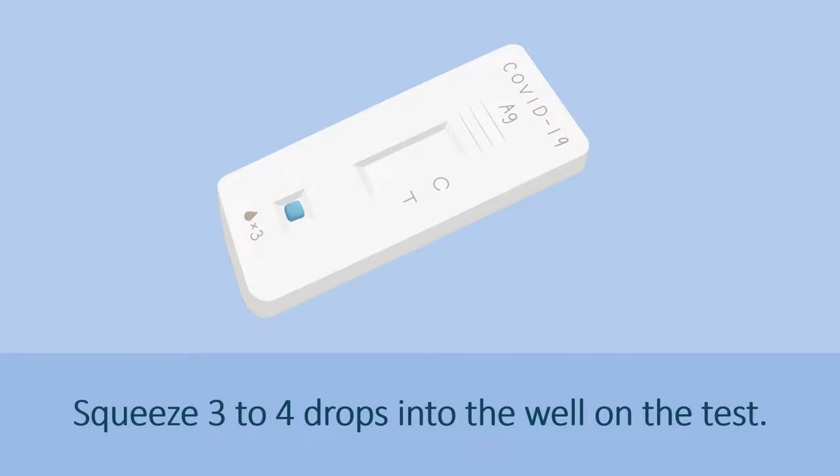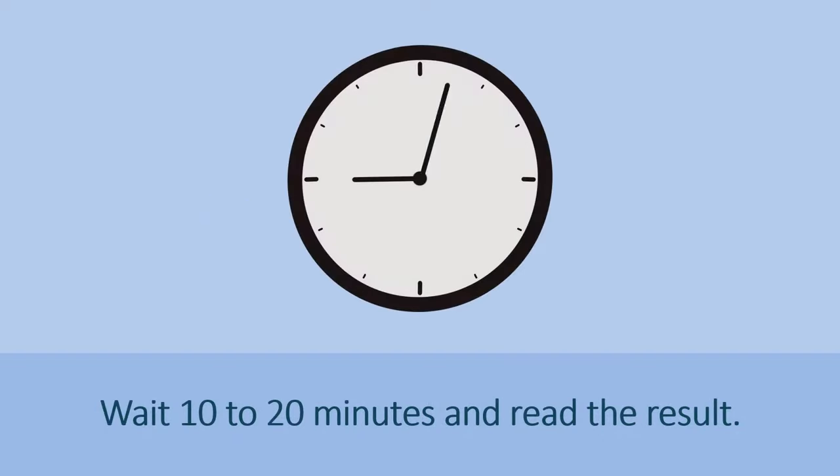Squeeze 3 to 4 drops into the well on the test. Wait 10 to 20 minutes and read the result.